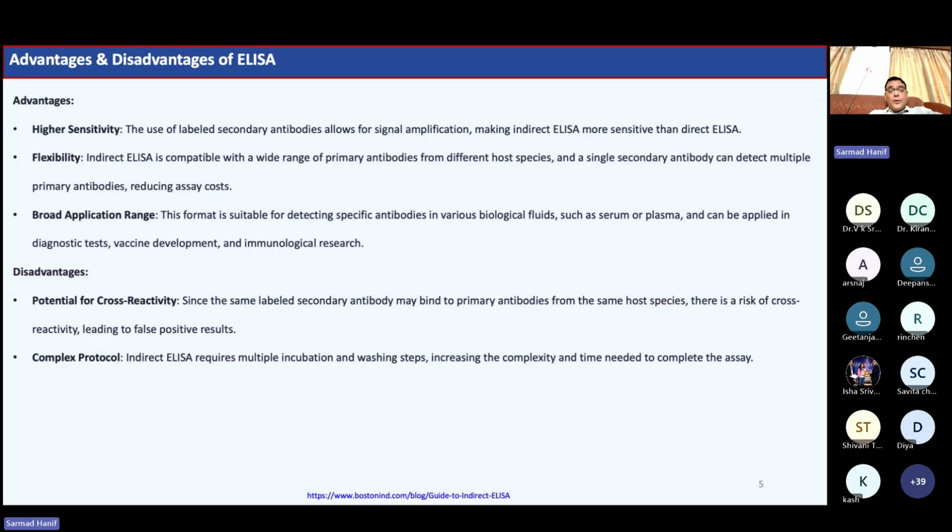So it can go and bind to too many different kinds of primary antibodies. But there are ways and means to tackle it, and we do that in the ELISA to make sure that it is not binding to any other primary antibodies which are non-specific to that infectious disease in terms of having different kinds of samples. We rule that out to rule out the false positive results.